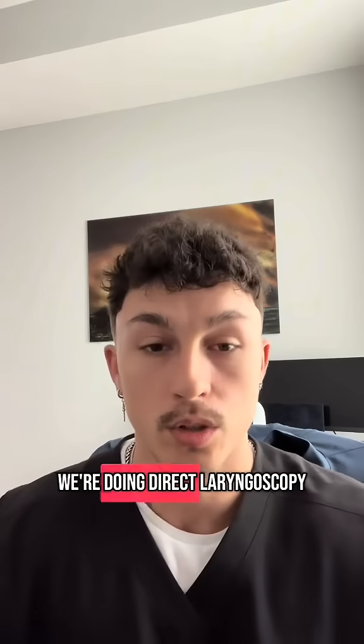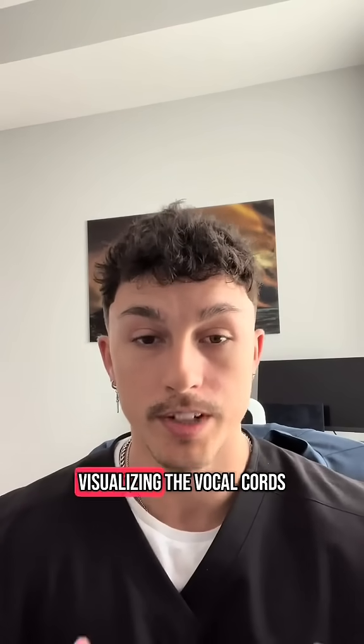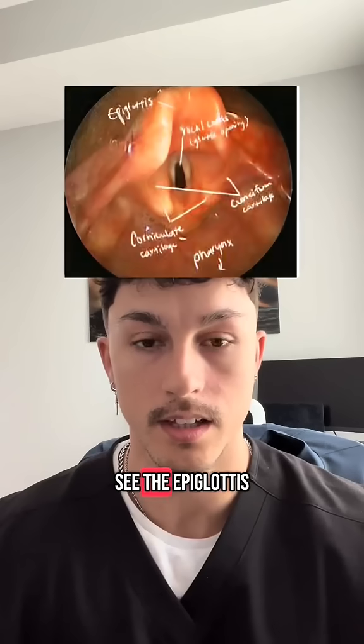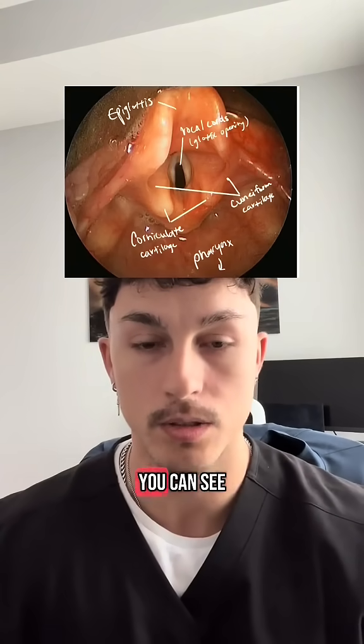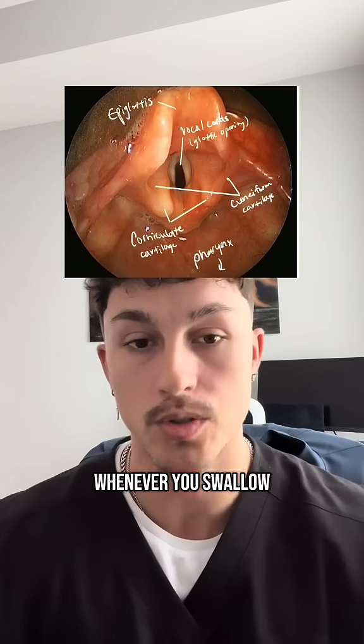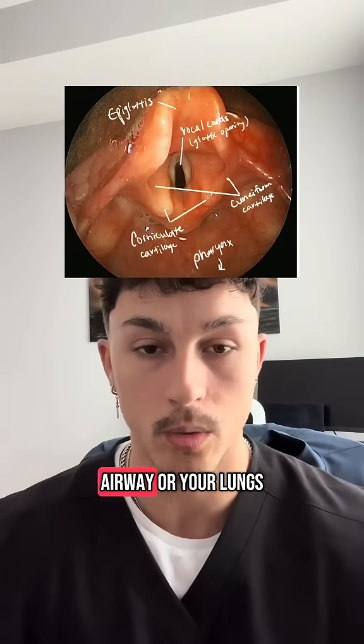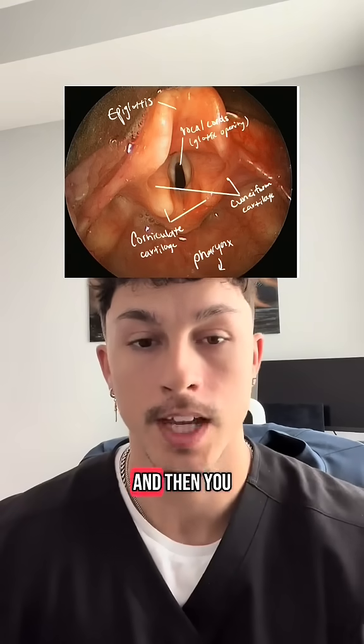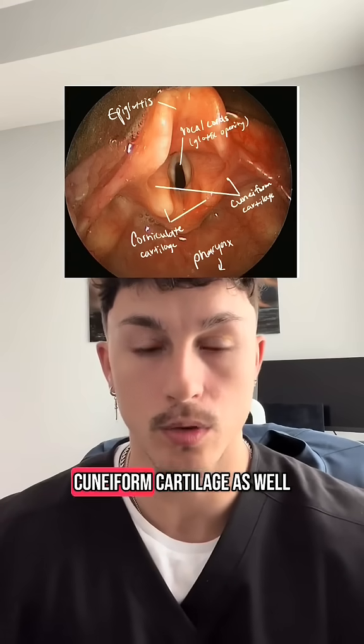So now when we're doing direct laryngoscopy, or when we're visualizing the vocal cords, you can see in this picture that we can see the epiglottis, which is that flap of tissue that normally closes whenever you swallow so that nothing goes into your airway or your lungs. And then you can see the vocal cords themselves. And then you can see the corniculate and the cuneiform cartilage as well.